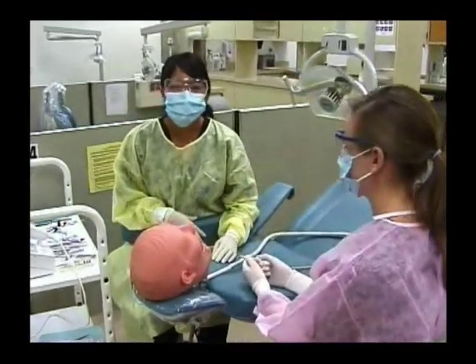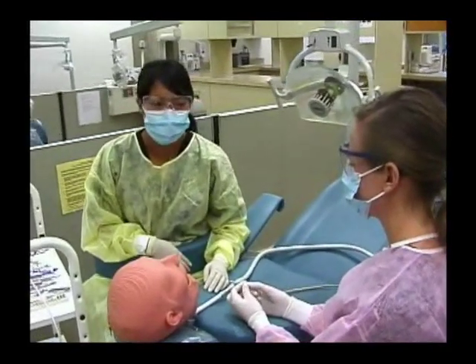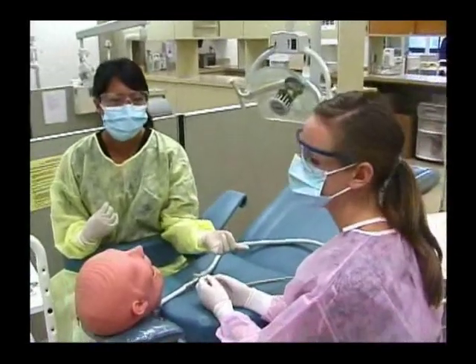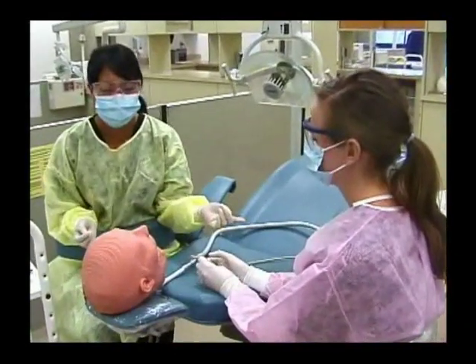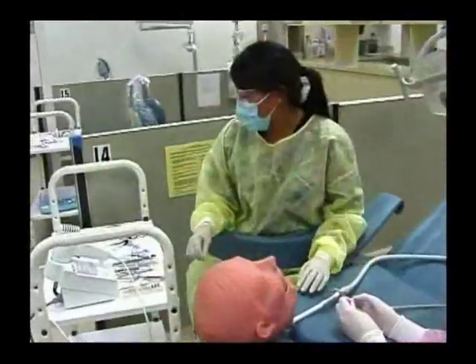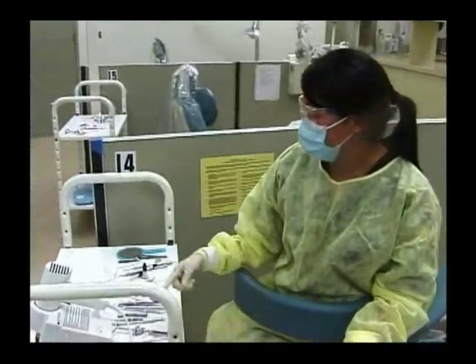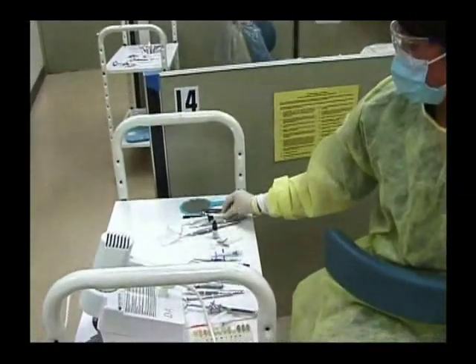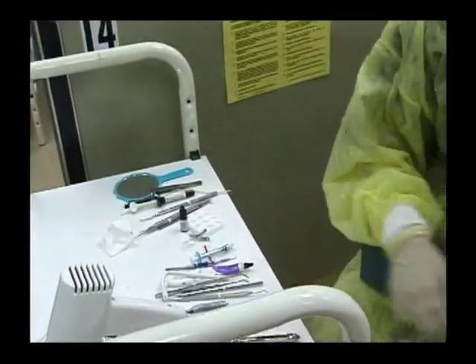Hi, my name is Misha and I'm a student at Cypress College in the Registered Dental Assisting Program. I'm going to play the Dental Assistant, and Victoria is another Cypress College student in the Dental Assisting Program and she's going to play the doctor. I'm going to show you an example of a composite procedure — this is the setup, and part of learning all the steps is knowing all the different instruments we're going to use.